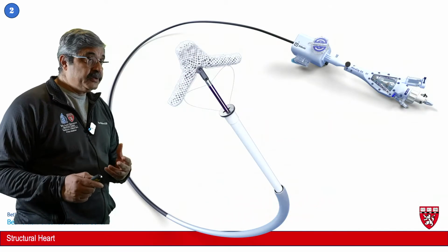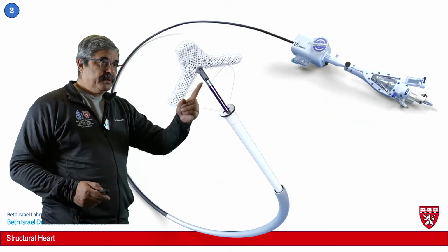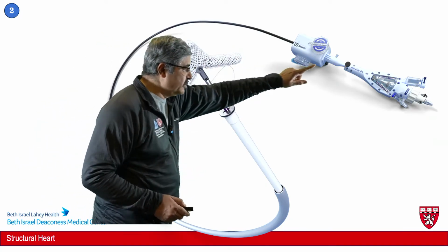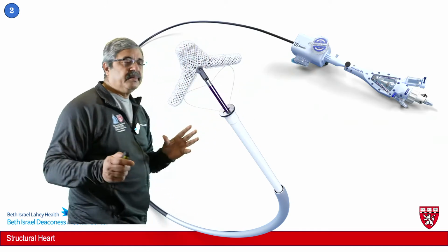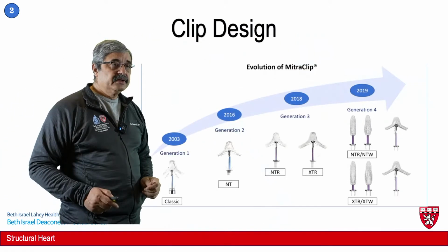Now, what ended up was this device, which is applied percutaneously, goes into the left side of the heart, and this is this contraption which stays outside the patient, and these knobs are used to guide the mitral clip in different positions and different directions in the heart that we'll go over to see how it is done.